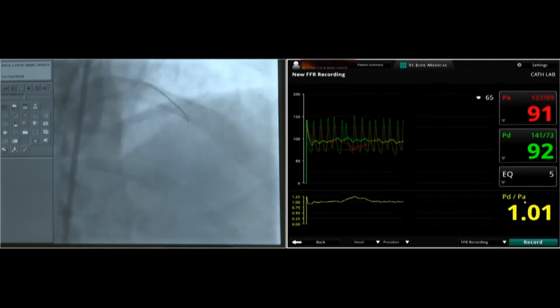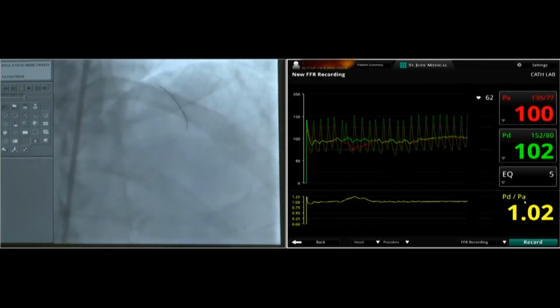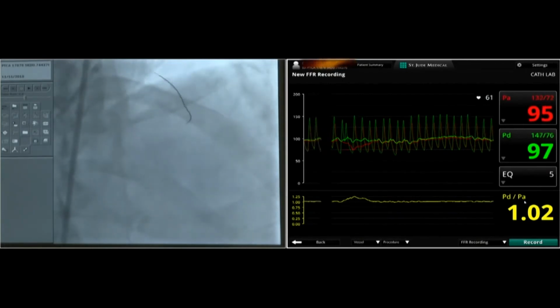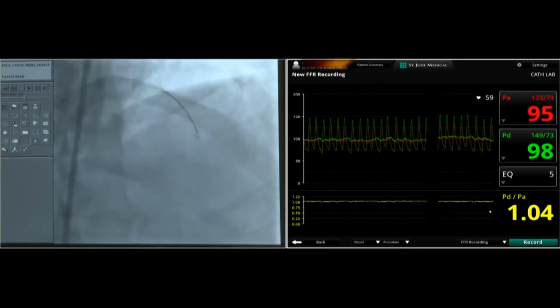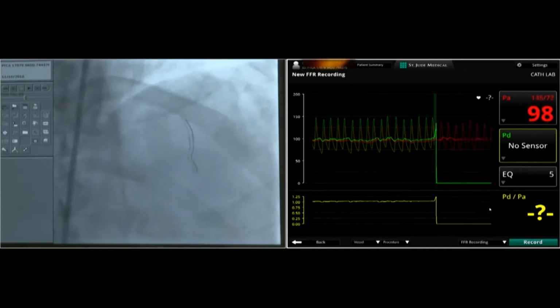The bend is now outside. Yeah, these are very poorly steering wires. Sir, I often steer from the back torquer. Yeah, so that's what we're trying to do now.